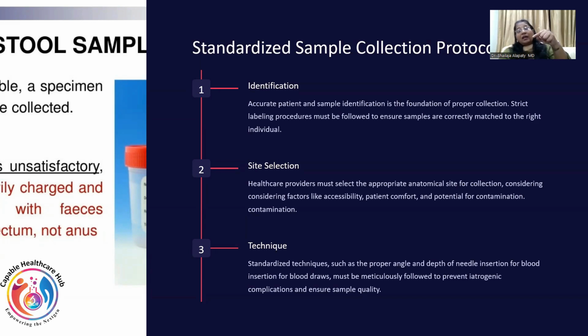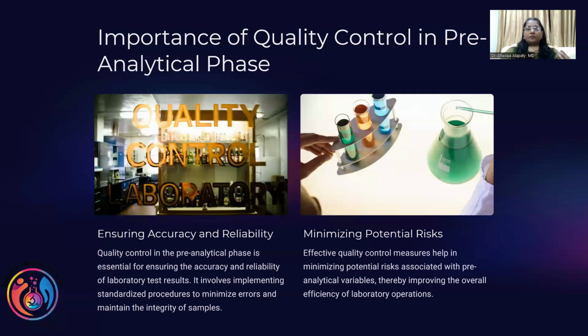Then where is the tip of the needle? And where is the opening? Is it up or down? Then have you pierced through the second layer and gone down? Is there hemolysis? Is there hematoma? So there are so many things that we should put systems into place for.